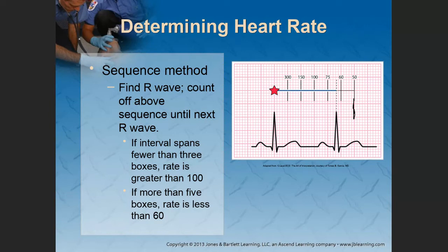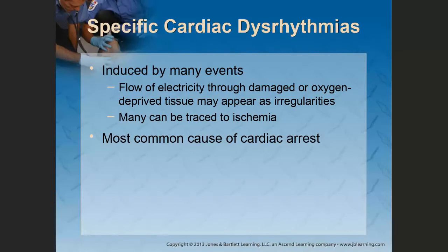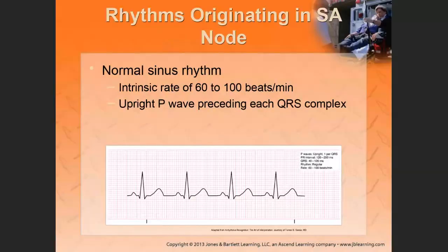All right, now with that said, let's move forward. I'm going to teach you that method. So let's apply the principles now. All right, so this is your first rhythm. And don't necessarily look at the rhythm, look at the ECG. So the type of rhythm is there, but focus on the ECG, right? Now, when you're going to identify a rhythm, you will look at the morphology of the rhythm, actual size.